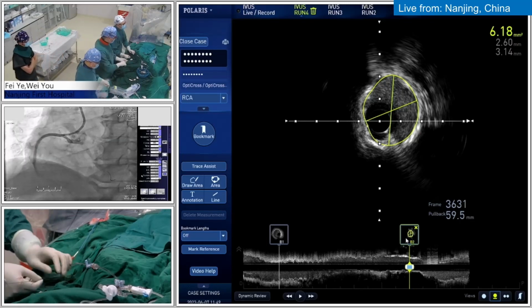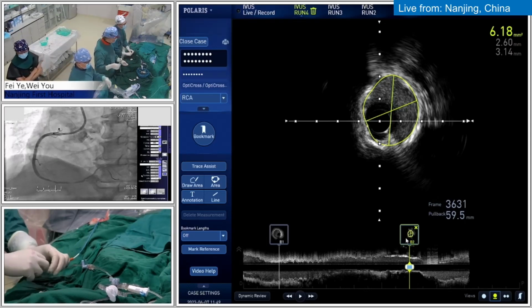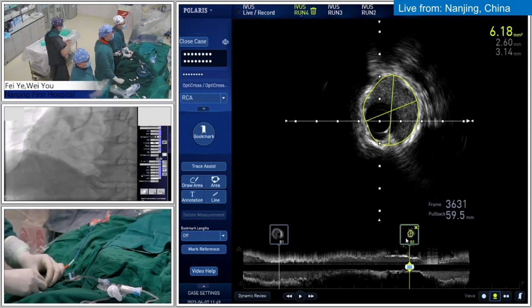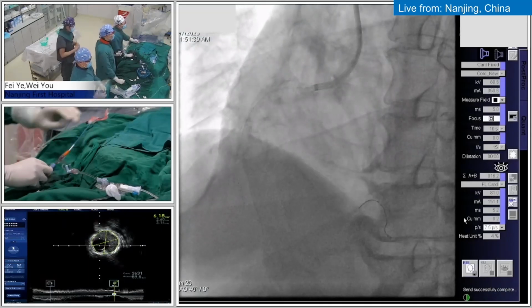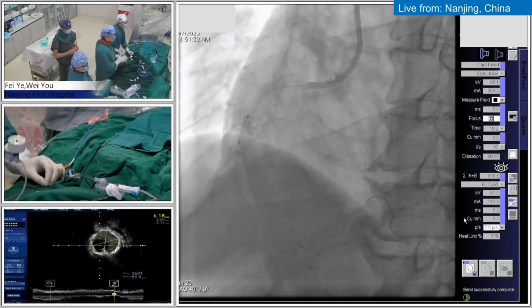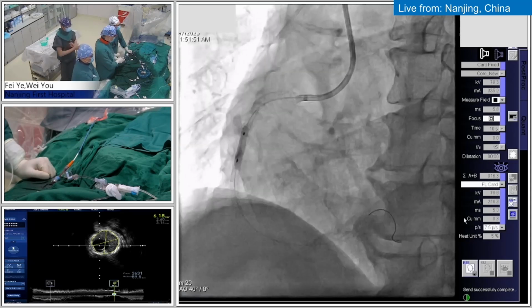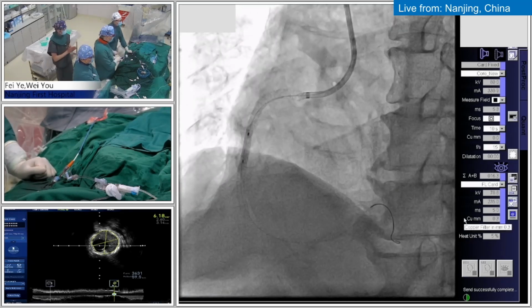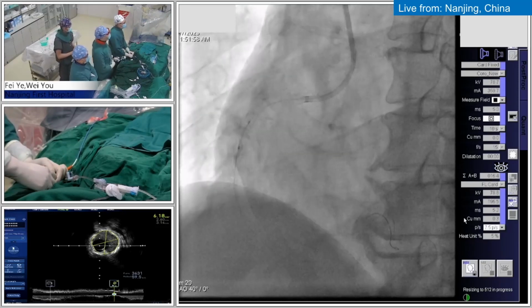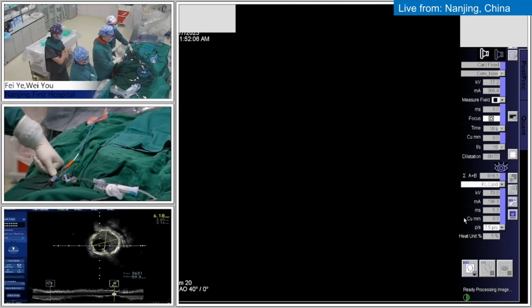So Chief, before stenting, if I use the 3.5 cutting balloon, maybe we will have a better result. That's why we want to combine the cutting balloon with the rotor. If we use the NC balloon for post-dilation after the rotor, we cannot make multiple cracks of the calcification. If we use a cutting balloon, we can make a lot of multiple cracks of the calcification compared with the NC balloon. That's why we want to always use the rotor combined with cutting.